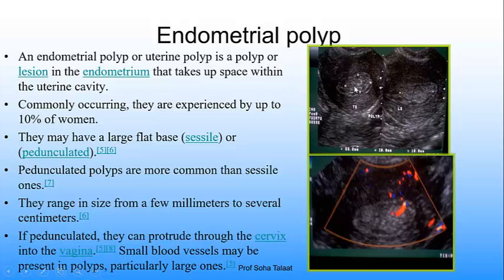And also if you see, there will be cystic changes inside, and this is more with the endometrial polyp. Usually the endometrial polyp on ultrasound is hyperechoic because it is arising from the endometrium. And here we confirm by Doppler that we have the vascular pedicle sign present. So this is the appearance of a polyp.